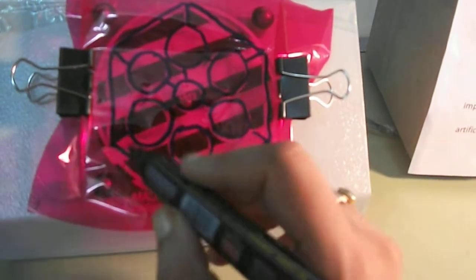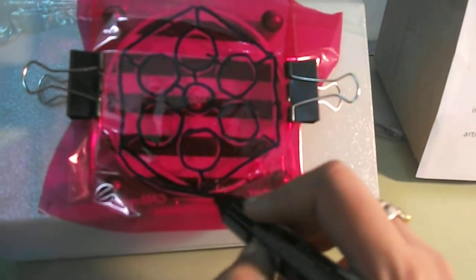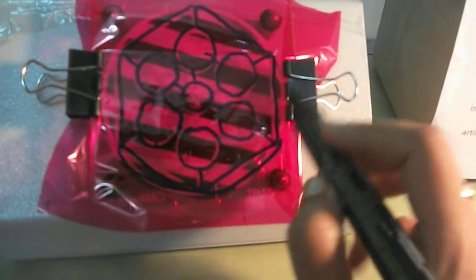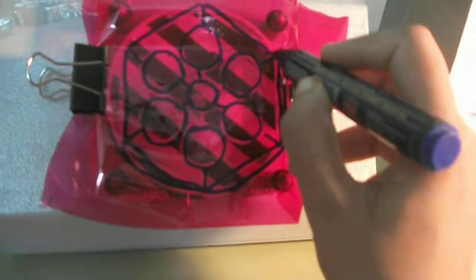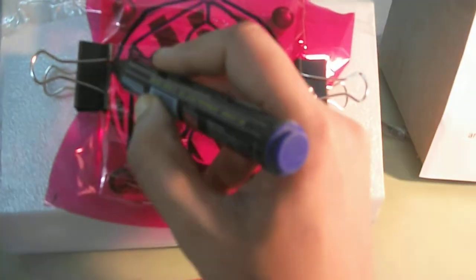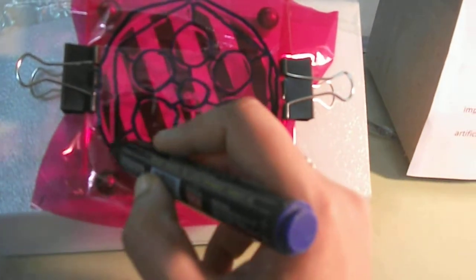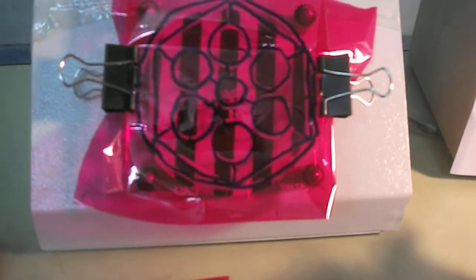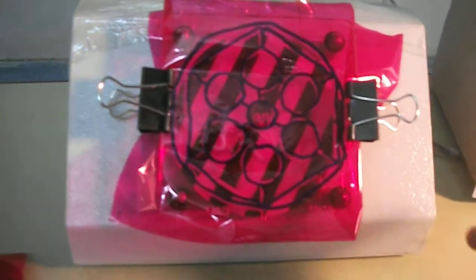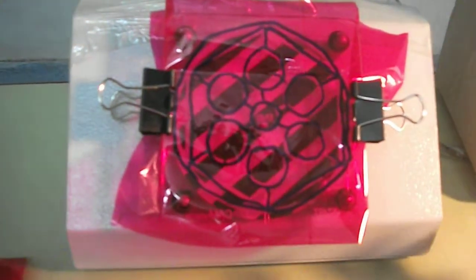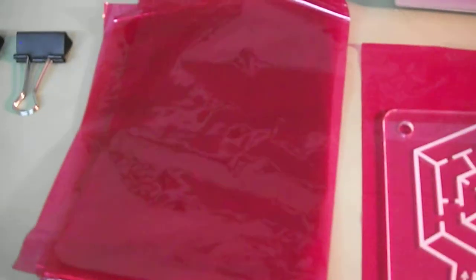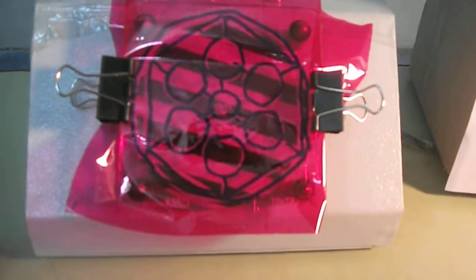Without the help of this machine, it is really difficult to get the desired result with only patching. So this is how the child will do it. Now you remove this strip and again place another cellophane paper and repeat the process in a similar way.